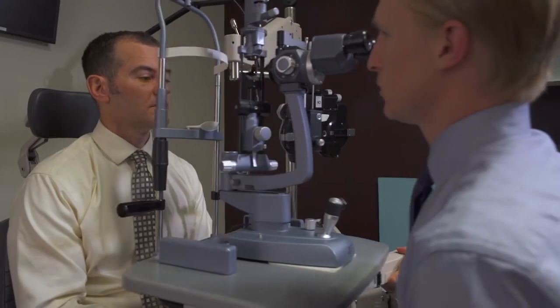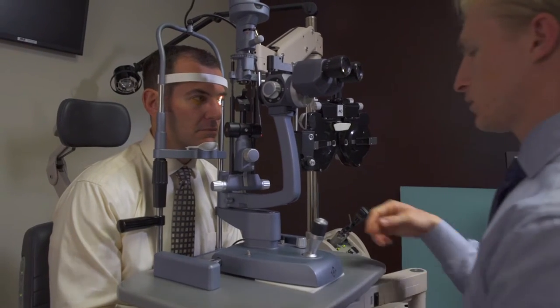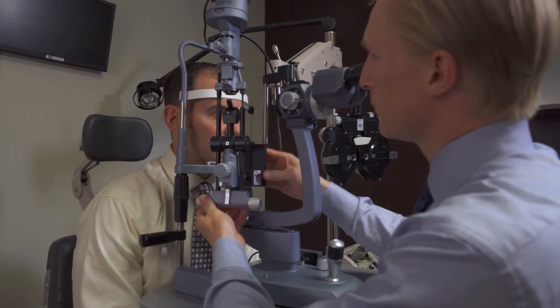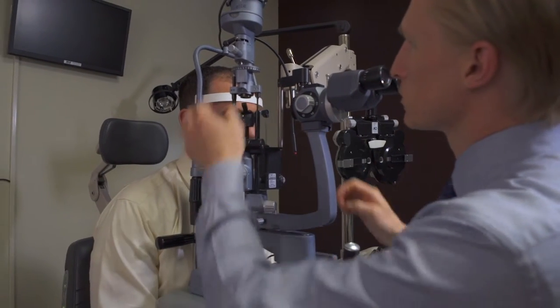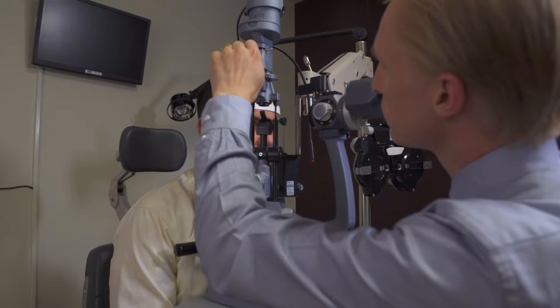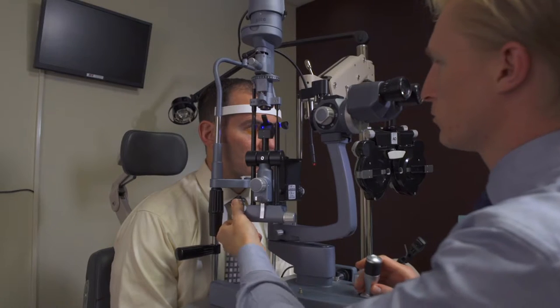That eye drop was fluorescein to help with the appearance on the mires so that you can see them when they're doing the pressure check. The way I like to check pressure is with the patient aligned at the slit lamp — bring the tonometer in, over to the cobalt blue light with a nice broad illumination.